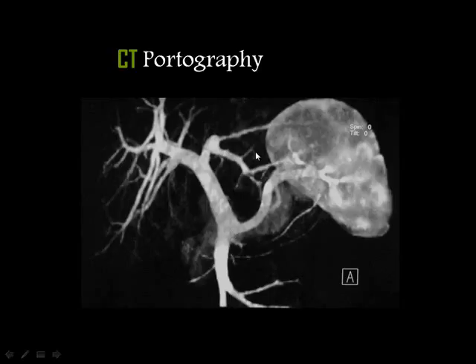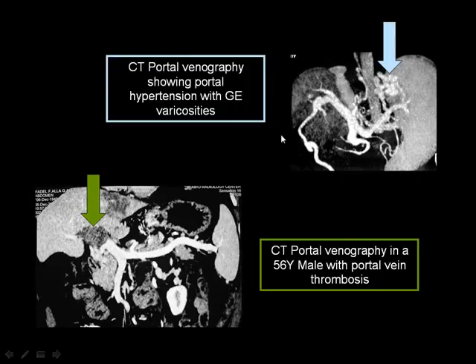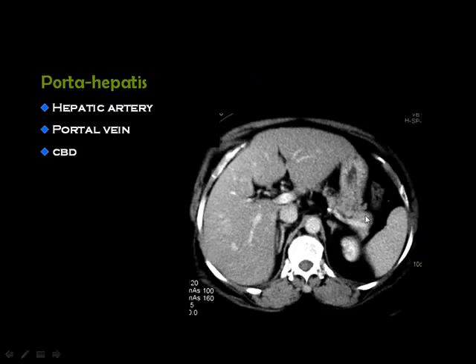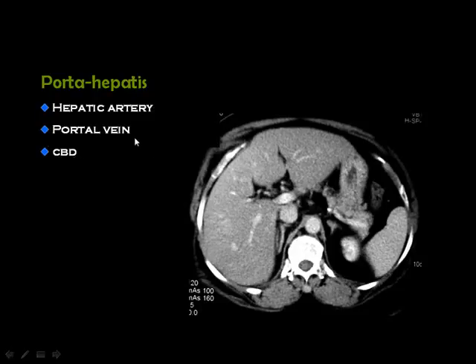CT portography demonstrates the portal vein, portal radicals inside the liver, splenic vein, and superior mesenteric vein, allowing easy diagnosis of abnormalities in the portal system. For example, in a cirrhotic patient with markedly enlarged spleen, you can see dilated tortuous vessels at the lower esophageal region representing esophageal varices, and a large thrombus inside the portal vein. At the porta hepatis, you can see fat and the portal vein; the hepatic artery is only visible in the arterial phase, and the common bile duct is only visible if dilated.